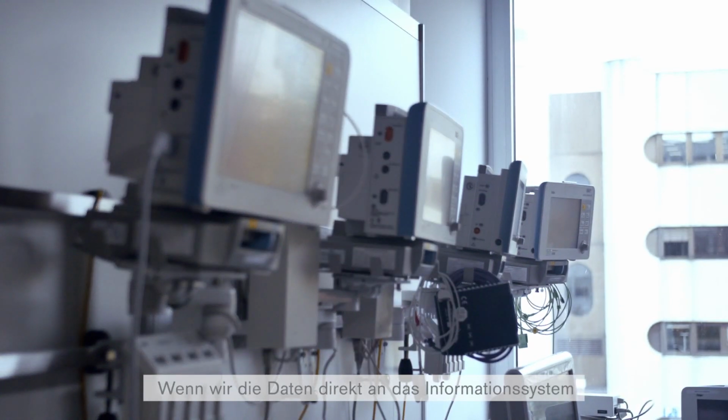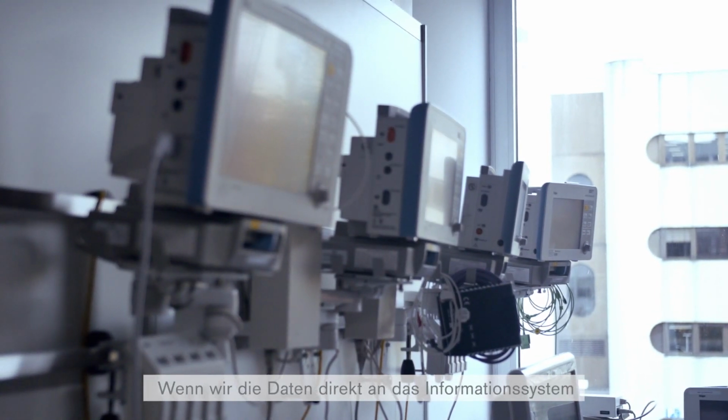When we look at sending the information directly to the information system, which is on the server, we use a proprietary protocol, which is the Draeger Infinity network. The data collection is the big data.